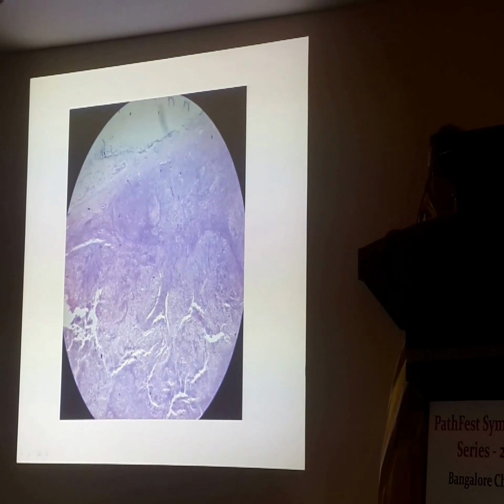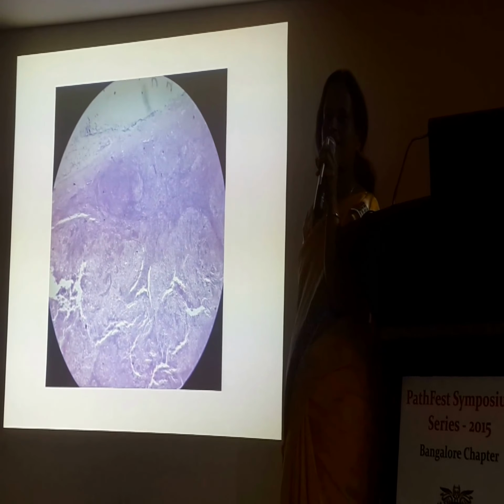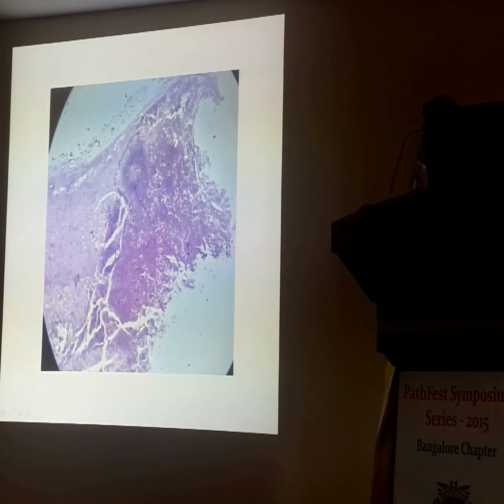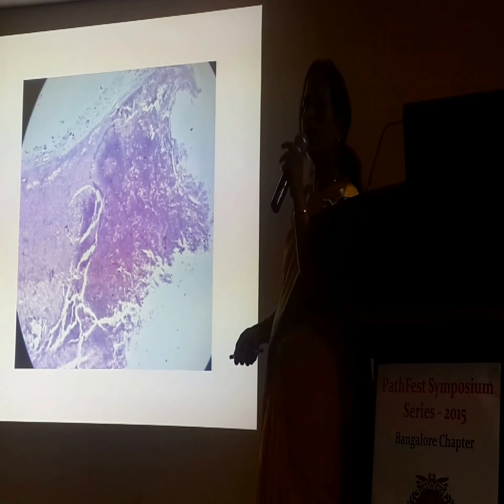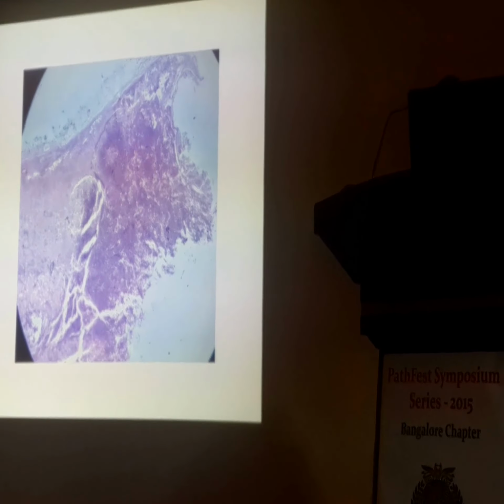What is it? Very bad picture, sorry. What is it? Lymph node, agreed. Lymph node? Yes. Nodal fat, capsule. And what do we see here? One, two follicles at least, with a prominent germinal center. Just a closer look at the follicles. Yes.